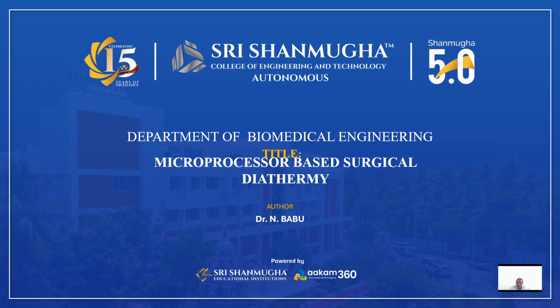Diathermy we have already seen: dia means through, thermy means temperature, through the temperature. It is used for diseases like pain and swelling. In older days, we applied heat by giving hot water treatment, which was also the olden days diathermy. Nowadays, we are applying electrical energy. That is diathermy.